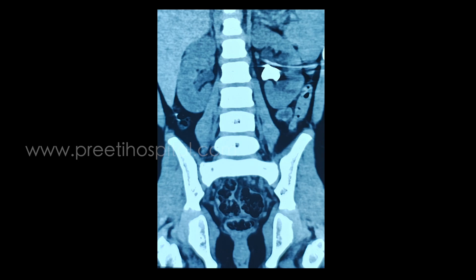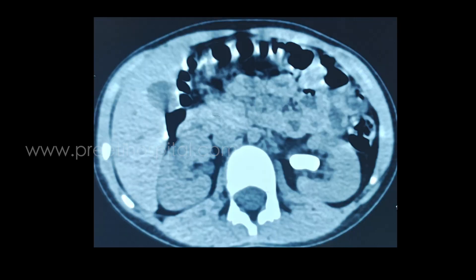After that, if you turn to 30 degrees and if the needle is going down on the screen, that means you have to go still more posterior. In this case, only a little downward movement was occurring, so I adjusted and turned the needle a little more posterior from the same entry point. It entered perfectly from the periphery of the calyx. As part of the live workshop, all these things make excellent teaching material for juniors.